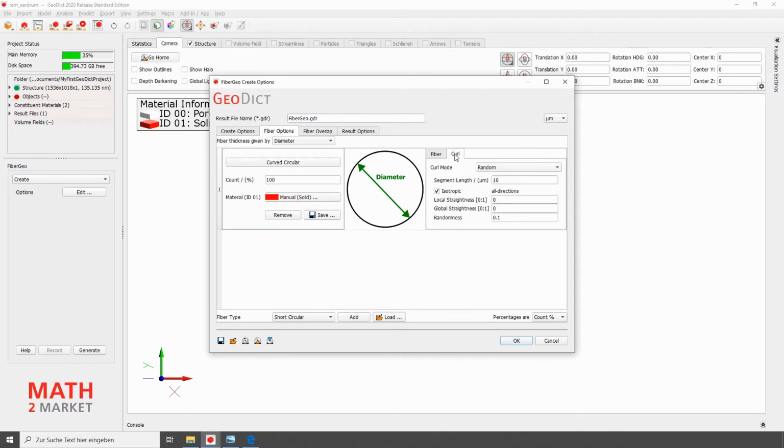Since these are curved fibers, we have to determine the parameters for the curvature. For this, we click on the Curl tab and select the Curl mode Random. With the other modes, it is possible to model defined geometric shapes or use another method to model the curvature, which is still under development.